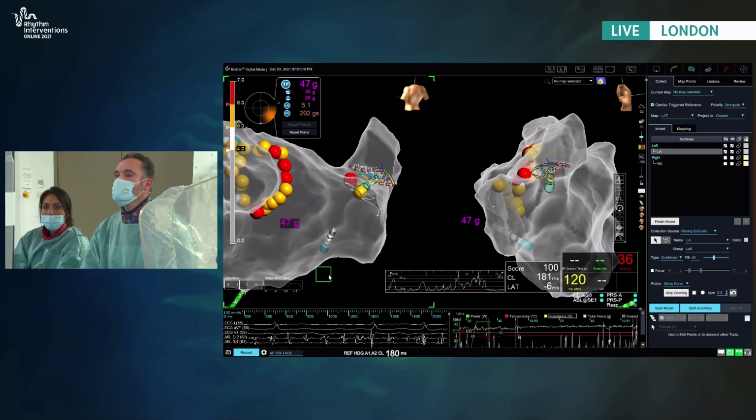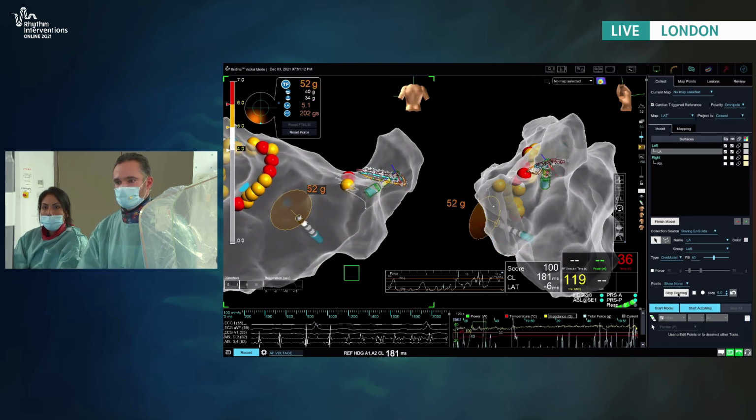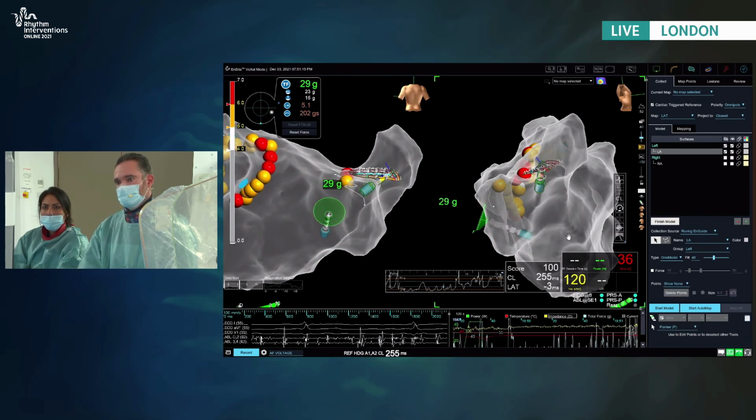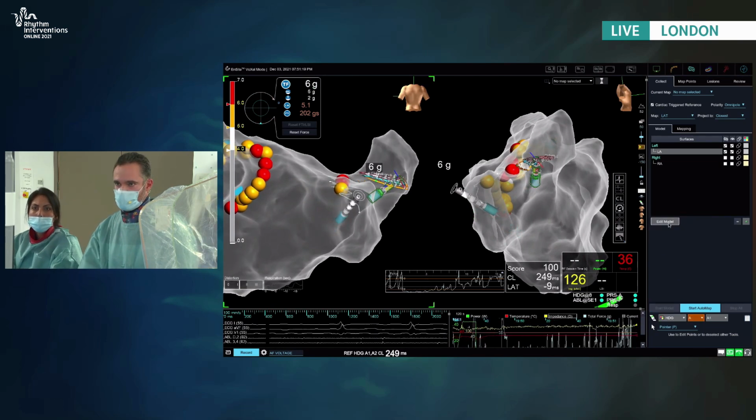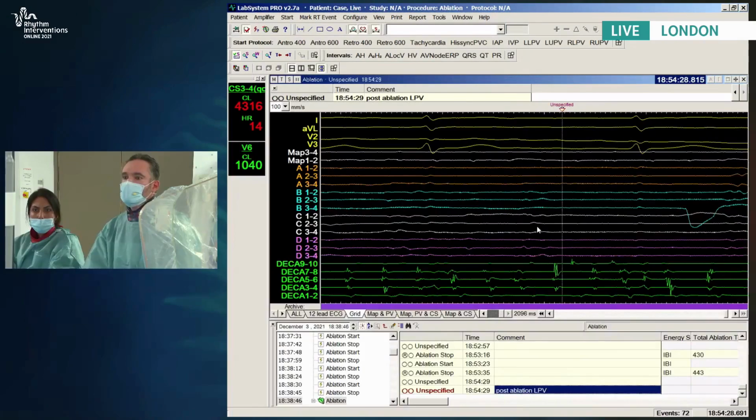And I go straight PA on the left now, shall I? Thanks. Ross, the guy's able to show us those electrograms. Oh, here we are. No, go ahead, Ross.